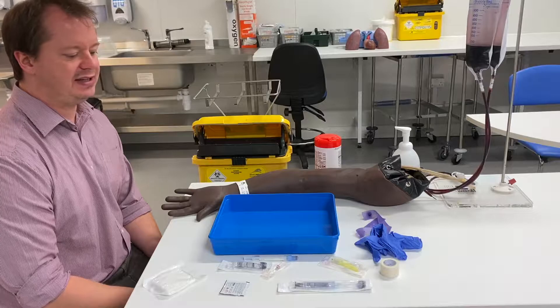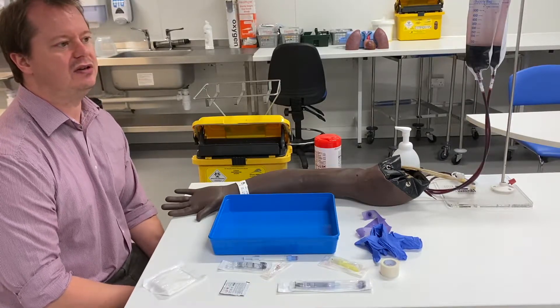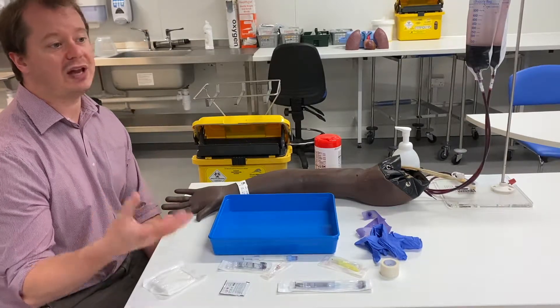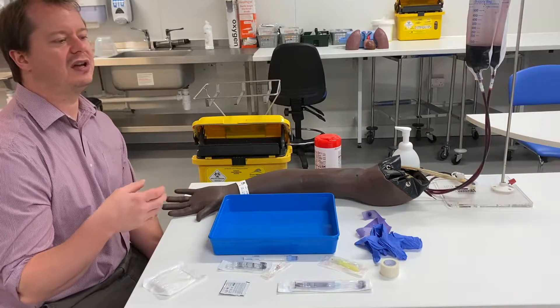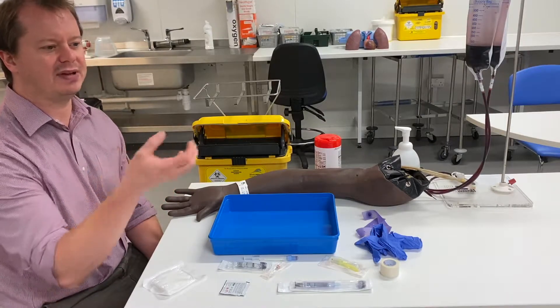Venous blood gases are a convenient, quick test that you can do that will look at some of the electrolytes, maybe look at your HB, your glucose, your lactate levels. They'll obviously tell you your pH, they'll tell you some things about oxygen levels and carbon dioxide levels of venous blood, and they'll tell you some of the metabolic aspects of the venous blood as well.